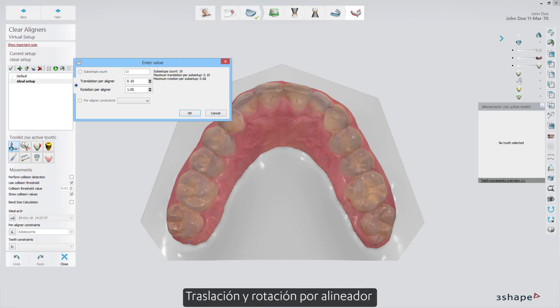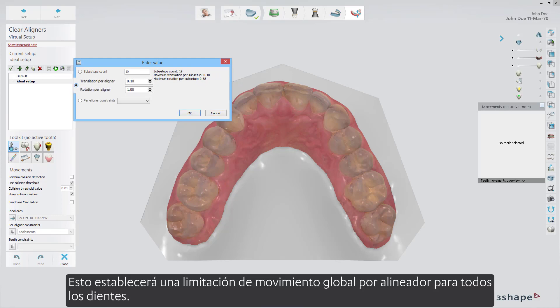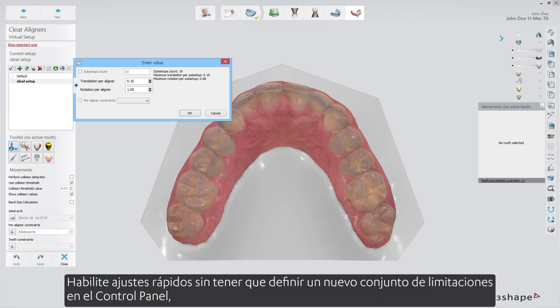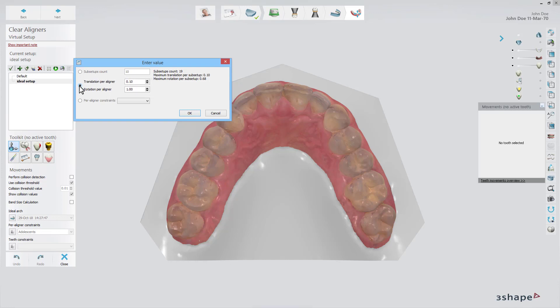The second method is Translation and Rotation per aligner. This will set a global per-aligner movement constraint for all the teeth, enabling quick adjustments without having to define a new set of constraints in the control panel.